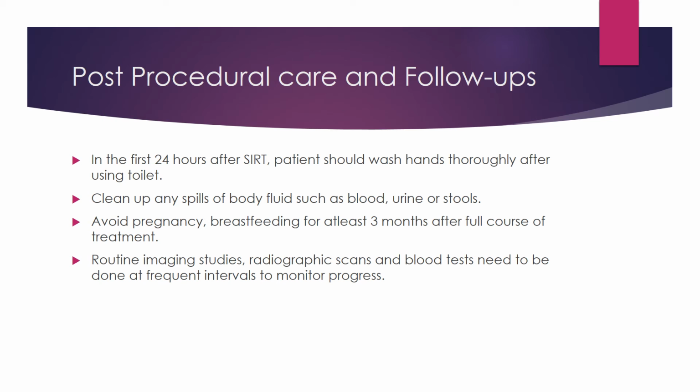For this patient, a 2-week follow-up CT scan was done which showed a reduction in the size of the tumor to 3.8 centimeters, and the patient did not have any major complaints. Hence, SIRT has contributed to decreasing the mortality and morbidity associated with malignant liver tumors and has been highly appreciated by many physicians and interventional radiologists.